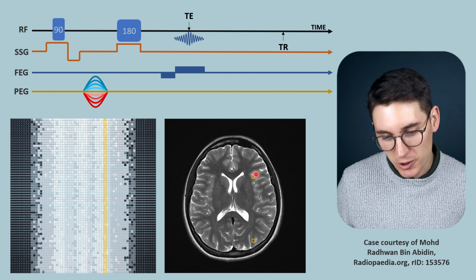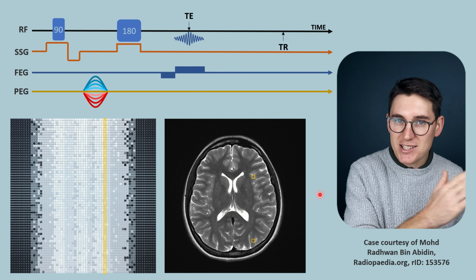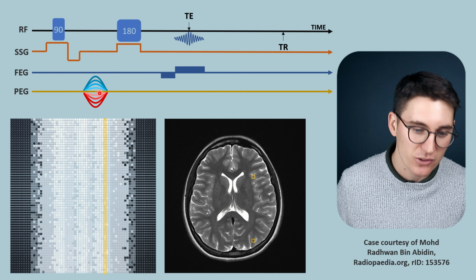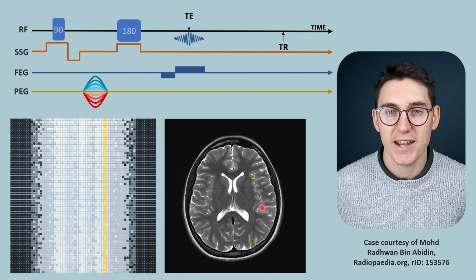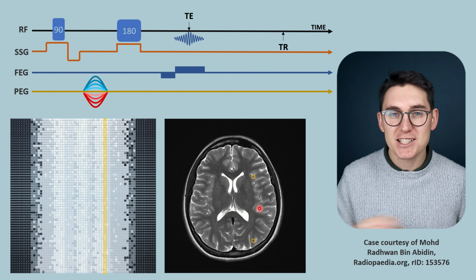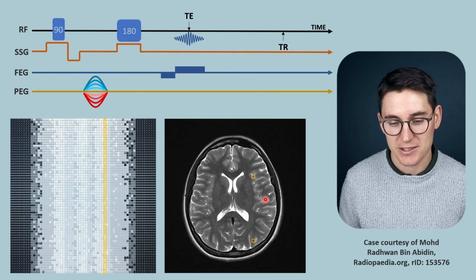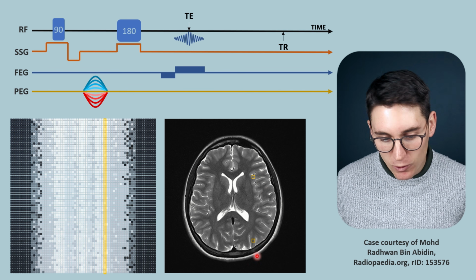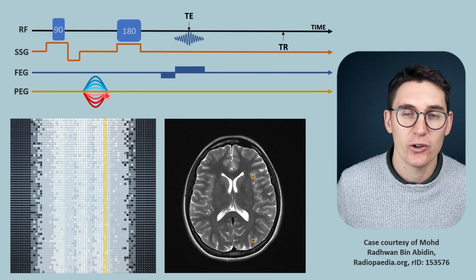Now, as we looked at before, depending on the y-axis location of these particular pixels, they will experience different degrees of dephasing as we expose them to different levels of phase encoding gradient. In order to calculate that degree of phasing, we first need to figure out what is the pixel value when these spins are perfectly in phase with one another. We first need that in our data set. Now, when will these pixels be perfectly in phase with one another? There will be no phase change along the y-axis when we don't apply a phase encoding gradient.